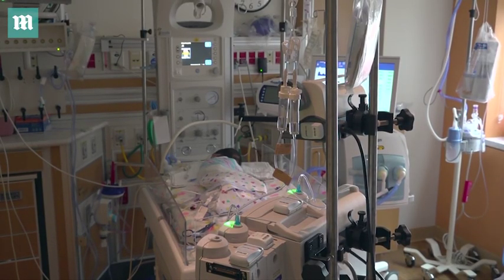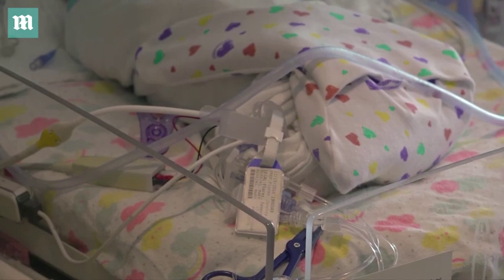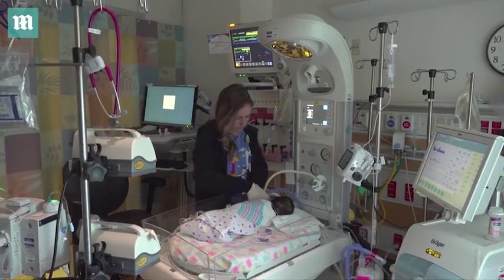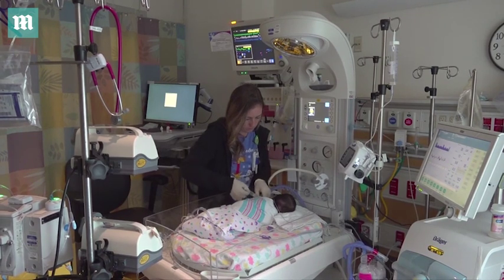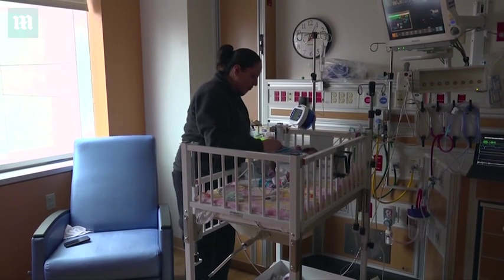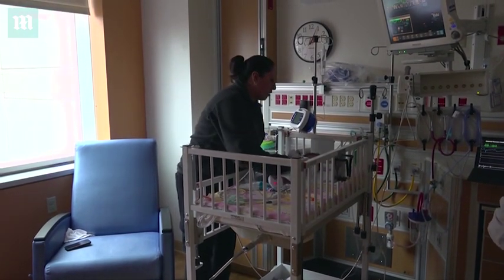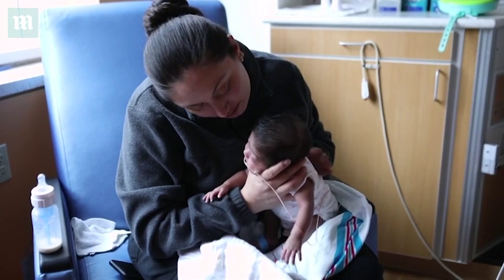And that means a problem. First of all, you can think about the poor babies — they're tethered to a bed, they can barely move. But for health care personnel, the doctor has to get through those wires to be able to evaluate the baby. The nurse has to deal with the wires to be able to turn the baby or to change the diaper. And for parents, it's a huge dilemma because that mass of wires creates a barrier between themselves and the baby.